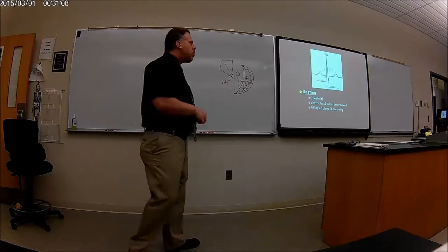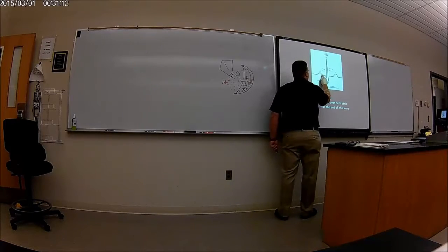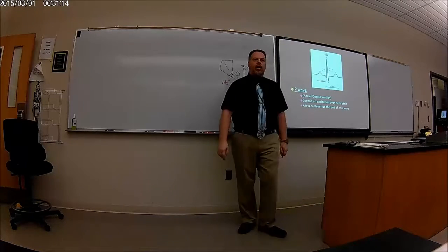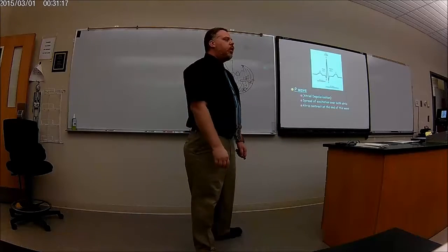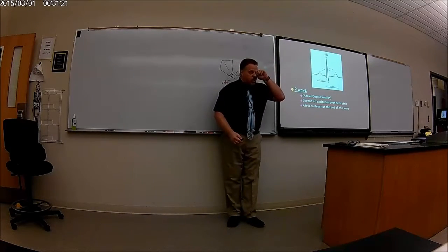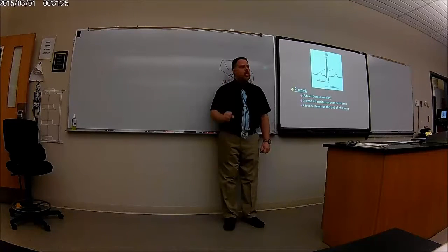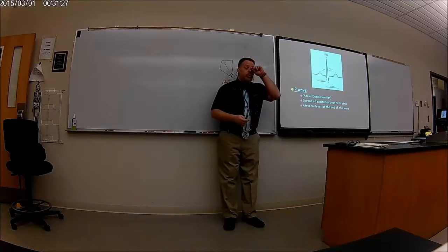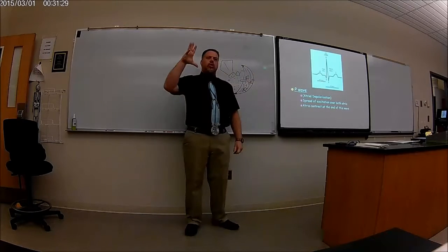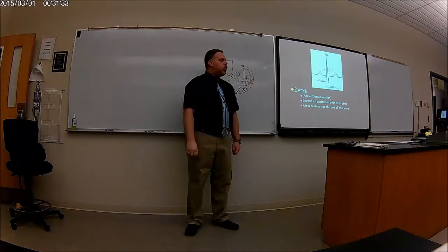Okay? Then what happens is something here, you got this little bump called the P wave. The P wave means that this is where atrial depolarization occurs. Atrial contraction occurs. It's going to put whatever blood is left there, usually 30%, and it's going to push or squeeze that blood into the ventricle.